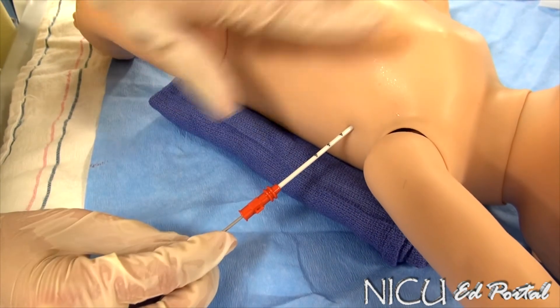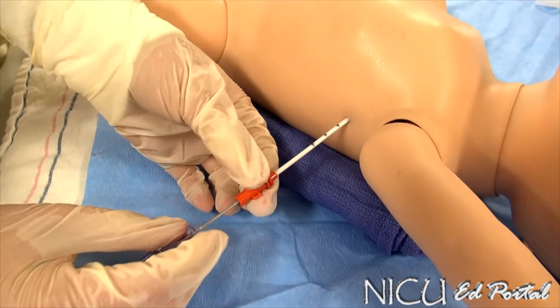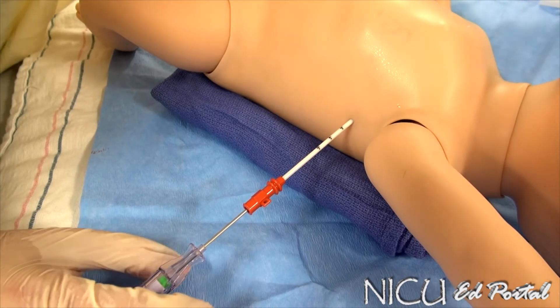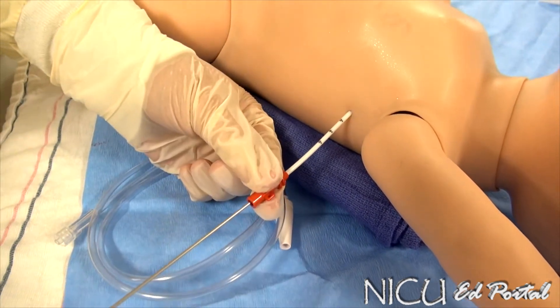Aim apically should it be a pneumothorax, and posteriorly should you be draining fluid. You then remove the needle fully.